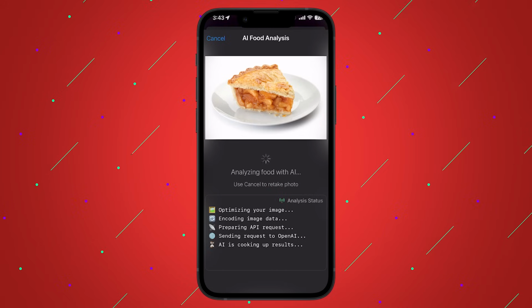You've trained this model to act like your diabetes educator that's giving you a fair amount of information. So once you do, let's say, a barcode, an image, a voice text, explain to me the little explanations you get, because I know there's a few different explanations you get.